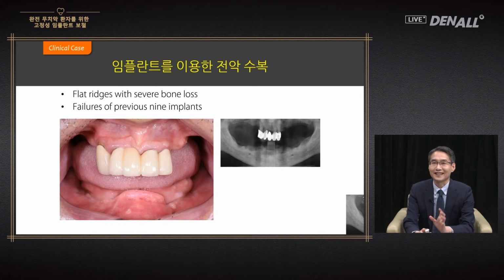I apologize. The image is in the wrong position, and the patient was using RPD, and there were few remaining teeth. In the case of lower, 9 implants were placed, but they all failed. I don't know what it was like before, but you can see there's a lot of bone destruction.